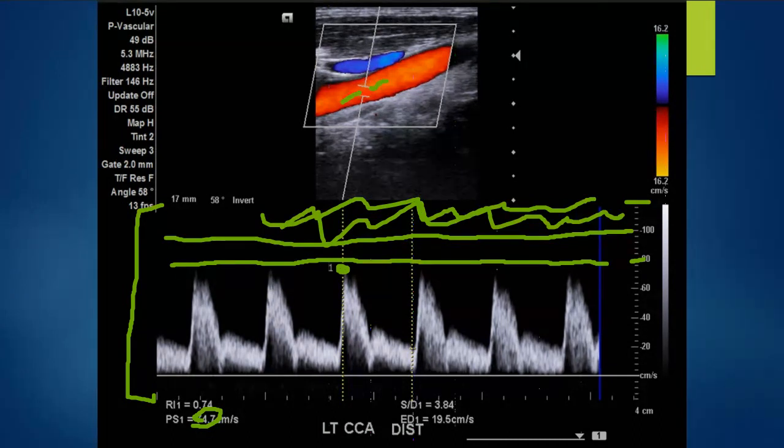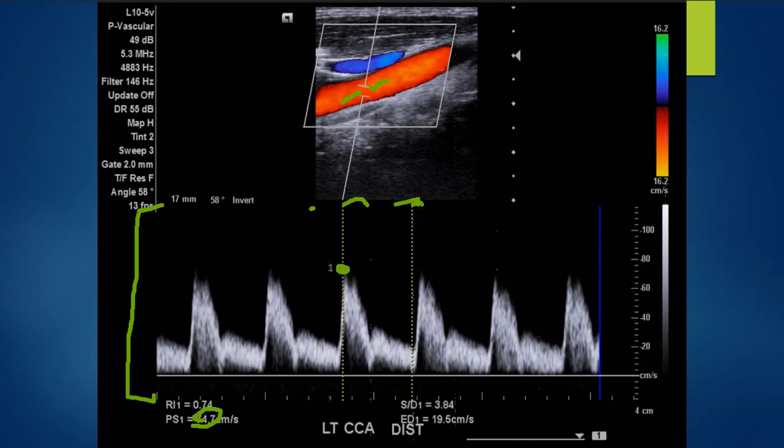Now, I'm going to erase what we have right here because there's a lot going on. Okay, if we set our scale at 40, right? We decrease, decrease, decrease. The top of our screen is 40.